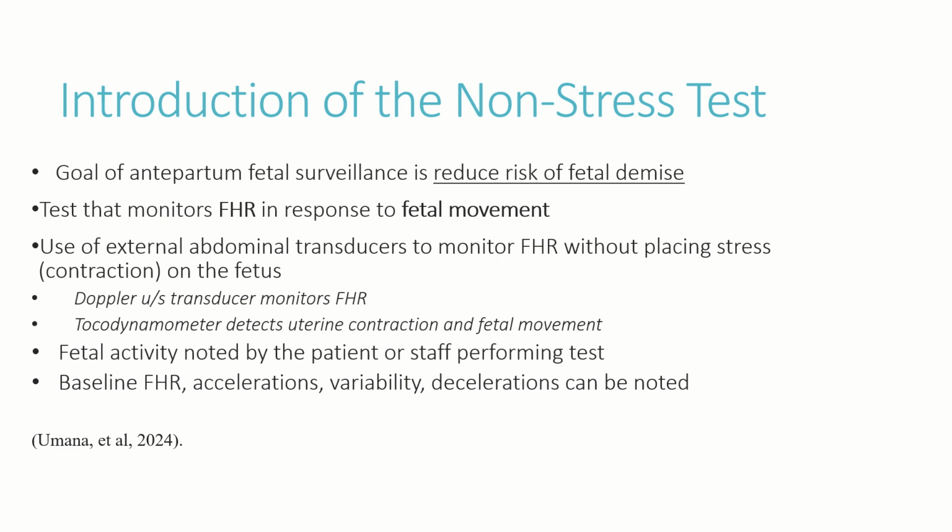Fetal activity can be noted and timed by the patient herself or by the staff performing the test. The staff member will note any important findings such as the baseline fetal heart rate, accelerations, variability, and decelerations.